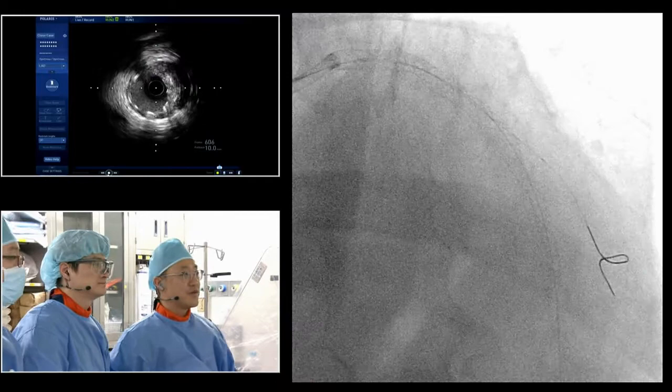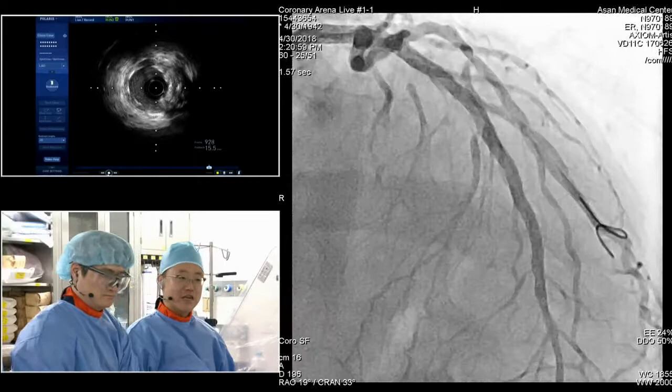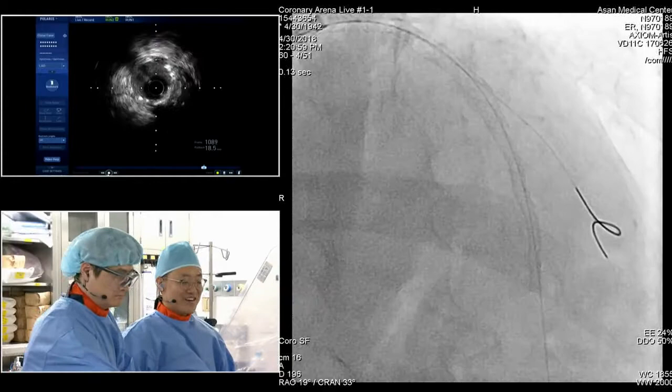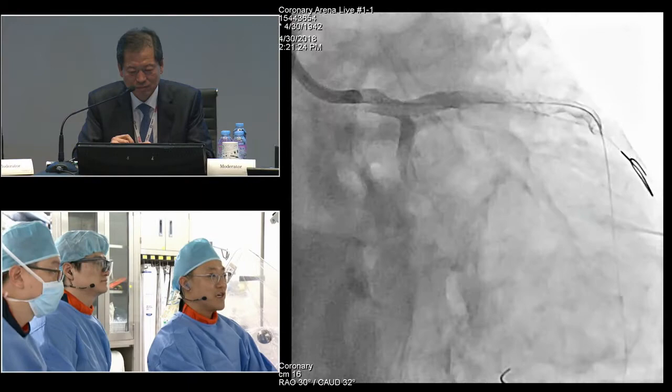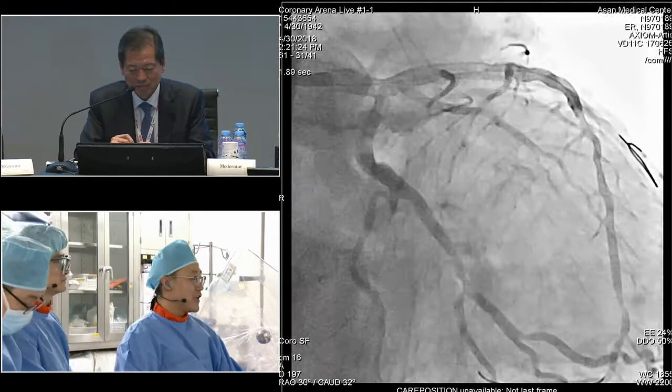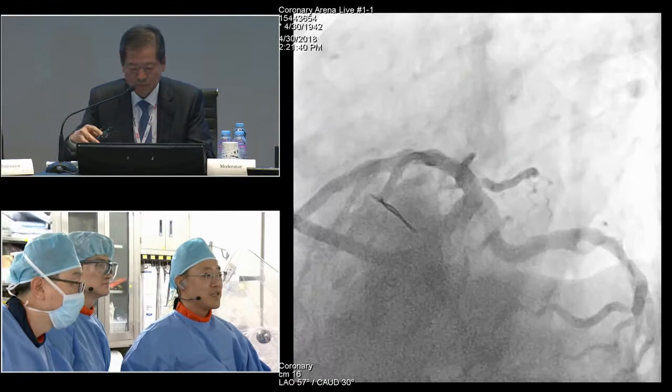Okay, angio, full shot. Okay, I think in this situation this is the best I can do. It looks excellent. Why don't you go to the RAO caudal? Okay, RAO caudal. Okay, great. 엔지오. 자, 풀샷. Okay, good. Great. Good. And then lastly, the spider, and then I'm gonna finish the procedure. 갑니다. 풀샷. Okay. Great. Okay.